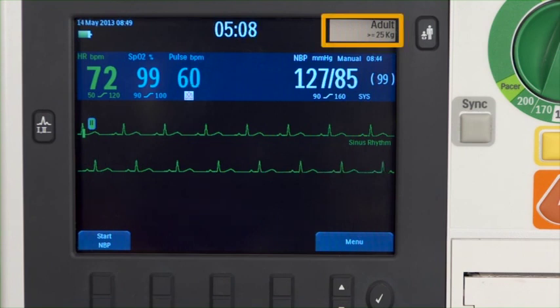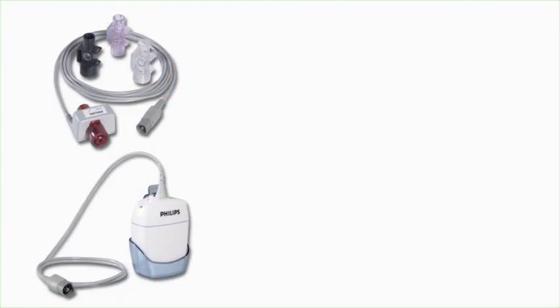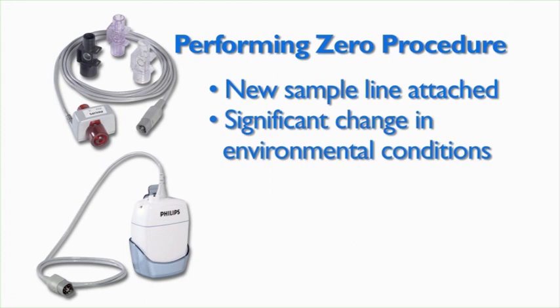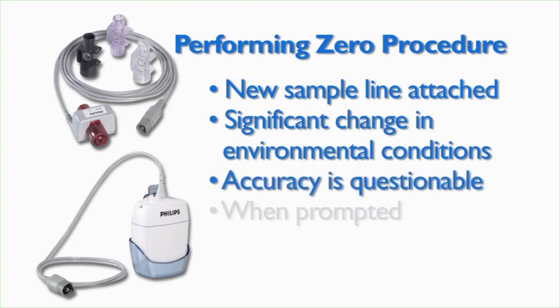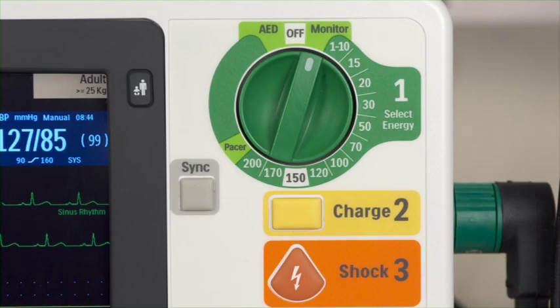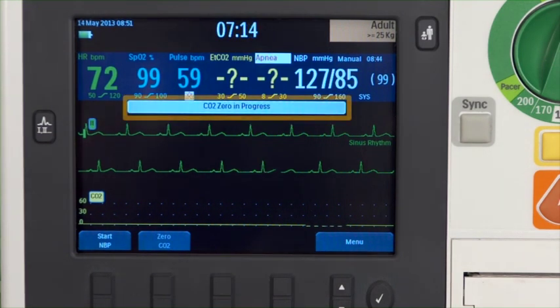Confirm that the patient category is appropriate for this patient. When a sensor is connected to the CO2 port, the measurement is automatically turned on. When using either the Philips Mainstream or Sidestream method for end tidal CO2 monitoring, you must reset the CO2 sensor by performing a zeroing procedure. This must be done anytime a new sample line is attached, there has been a significant change in environmental conditions, when accuracy of the reading is questionable, or when prompted by the HeartStart XL Plus. Zeroing can be done using the Zero CO2 soft key or via the menu. In this case, we'll demonstrate the procedure using the soft key. Confirm the HeartStart XL Plus is in monitor, manual defib, or pacer mode. Press the Zero CO2 soft key and the CO2 zero in progress message appears on the display.